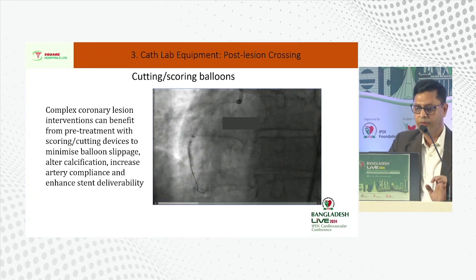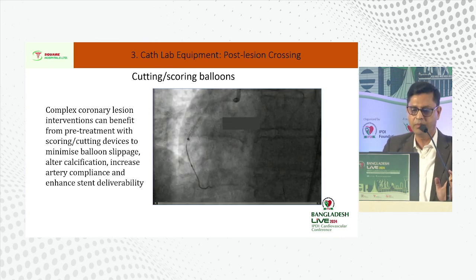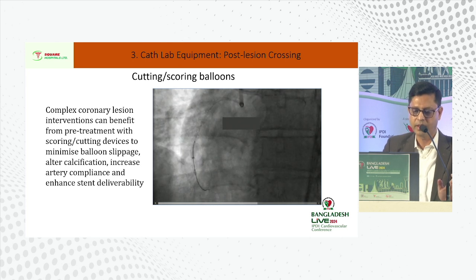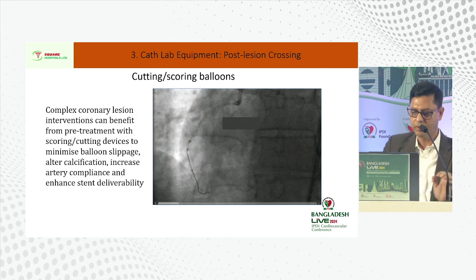And there's a different issue of cutting or scoring balloon. Basically, complex coronary lesion interventions can benefit from pre-treatment with scoring or cutting devices to minimize balloon slippage, alter calcifications, increase artery compliance, and enhance the stent delivery system. You can see here in the video on the right side.